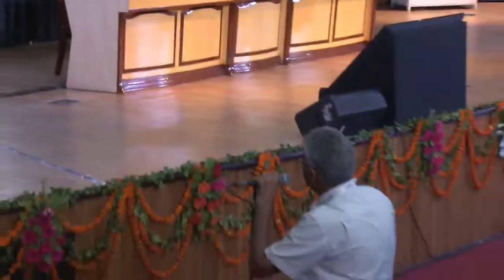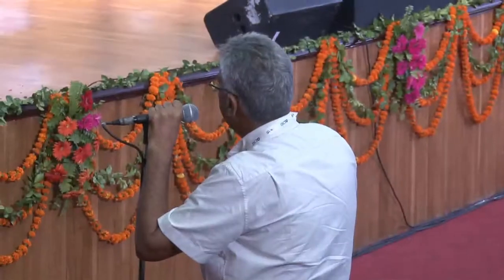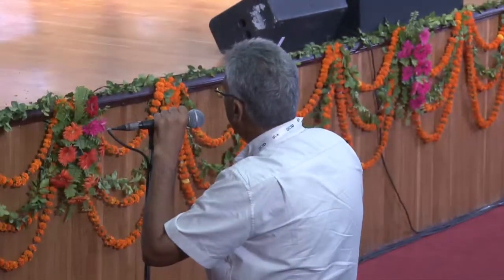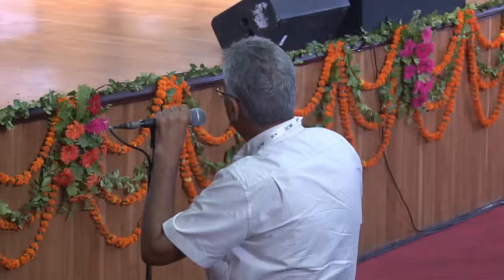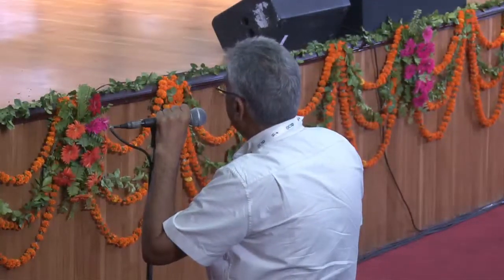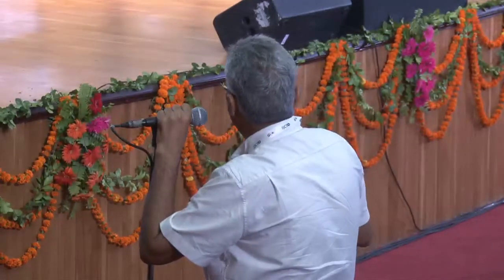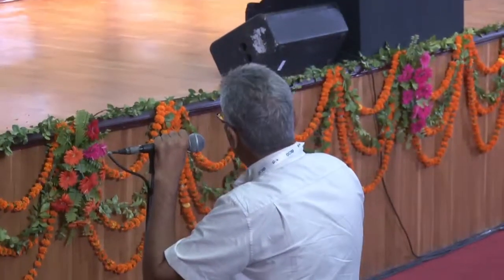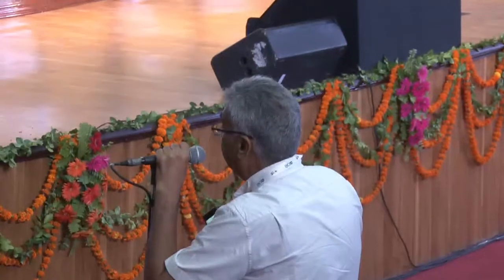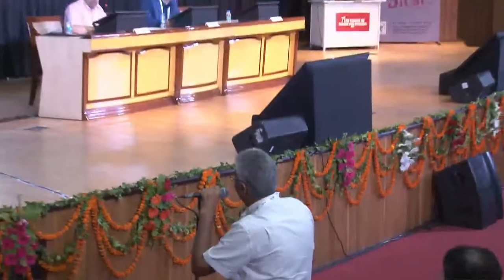Vijay, one simple thing which works sometimes is that when you cross a CTO, usually those wires are not very good support wires. If you are able to change to something like an All-Star wire, which has much more support, either through a micro or even if the micro doesn't go, I agree with you, micros these days are not very good. But that's a supportive wire. For example, particularly in a right coronary artery, if you are able to pass an All-Star wire, I tell you that sometimes the balloon will go over this.